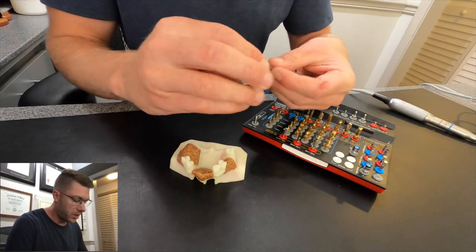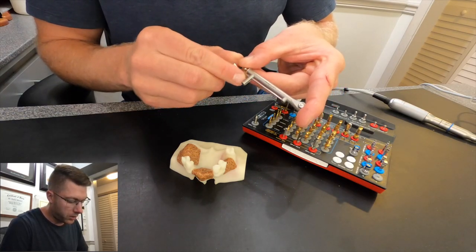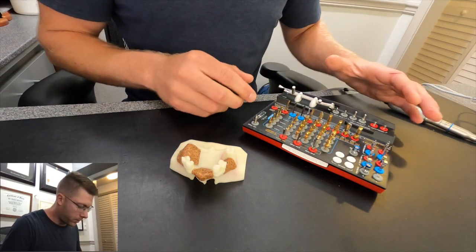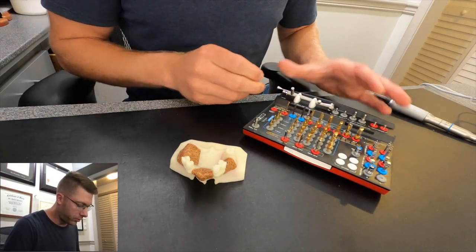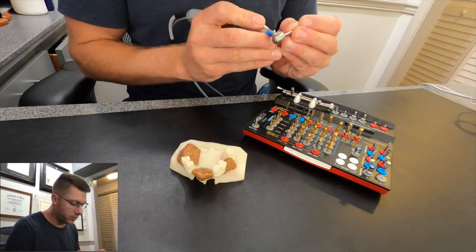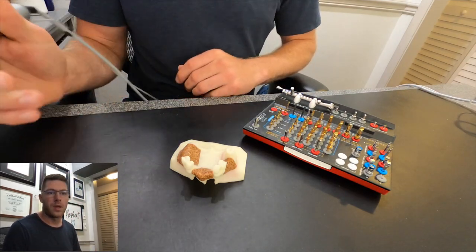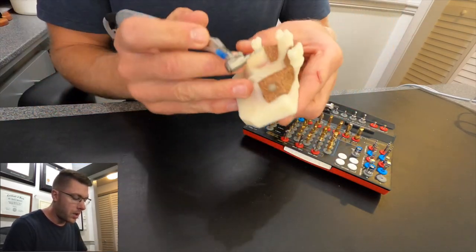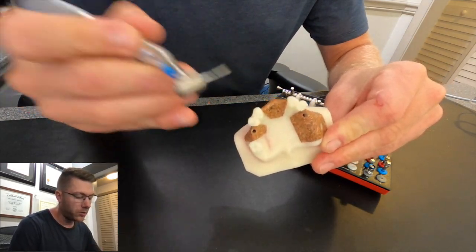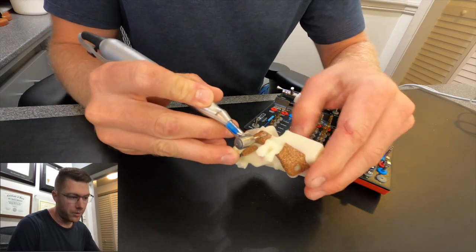This is a mechanical torque wrench with markings right here so I know how tight the implant is torquing to. I'm going to start off with my first drill in the sequence — it's called a lance drill. It's just going to help me get started. I put this on my drill running at about 1800 RPM. I'm going to be placing one up front here. You can see the ridge is slightly angled backwards, so I'm going to make sure I'm running parallel to that so it doesn't poke out the front.